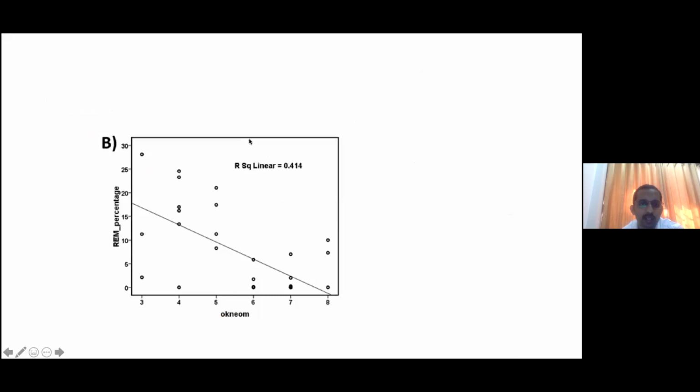So this is a token of the severity of eye movement velocity impairment. We find the degree of impairment, where 8 is the maximum degree. If there is less involvement, you have good REM sleep recognition. You are able to recognize a good amount of REM sleep.